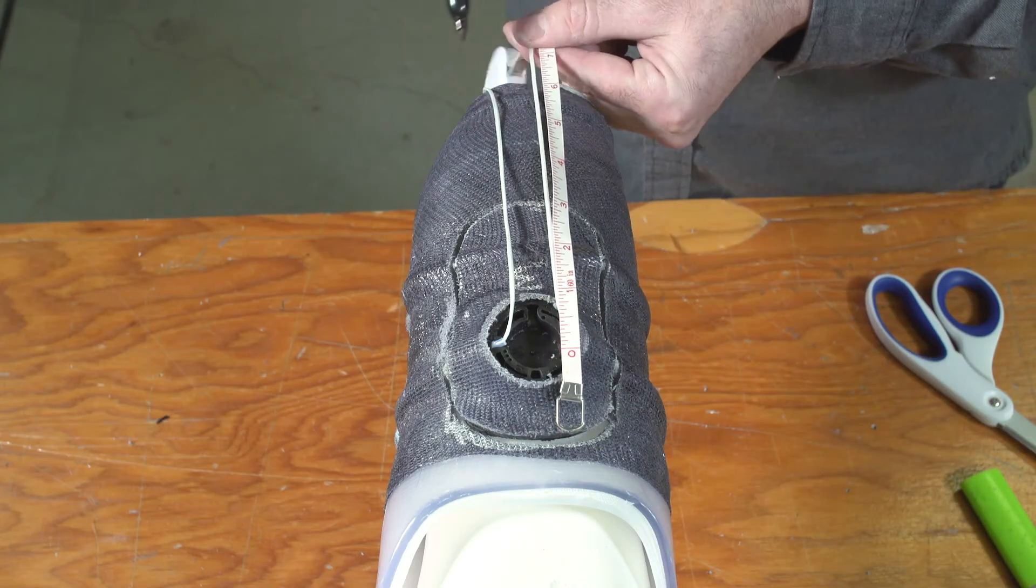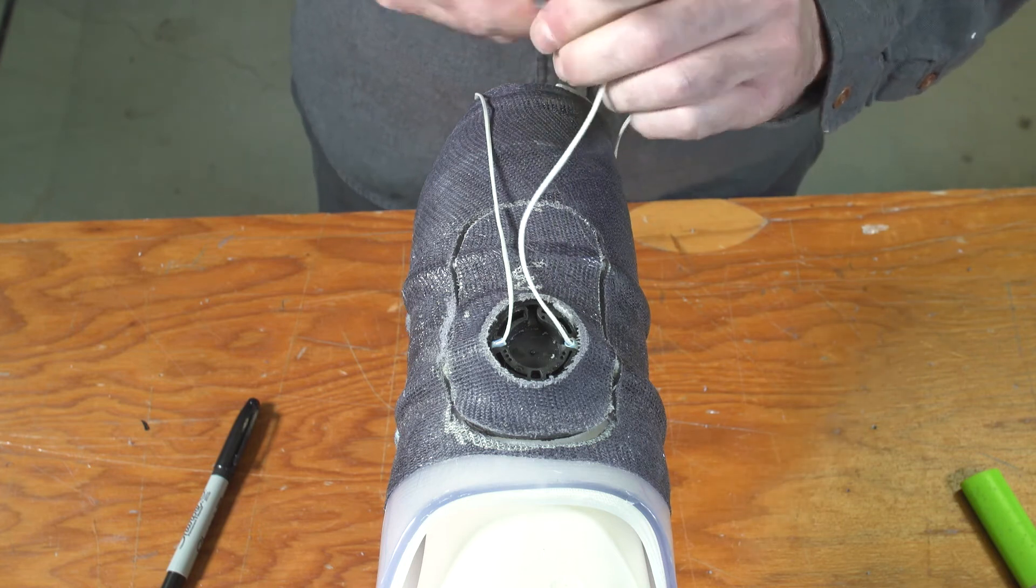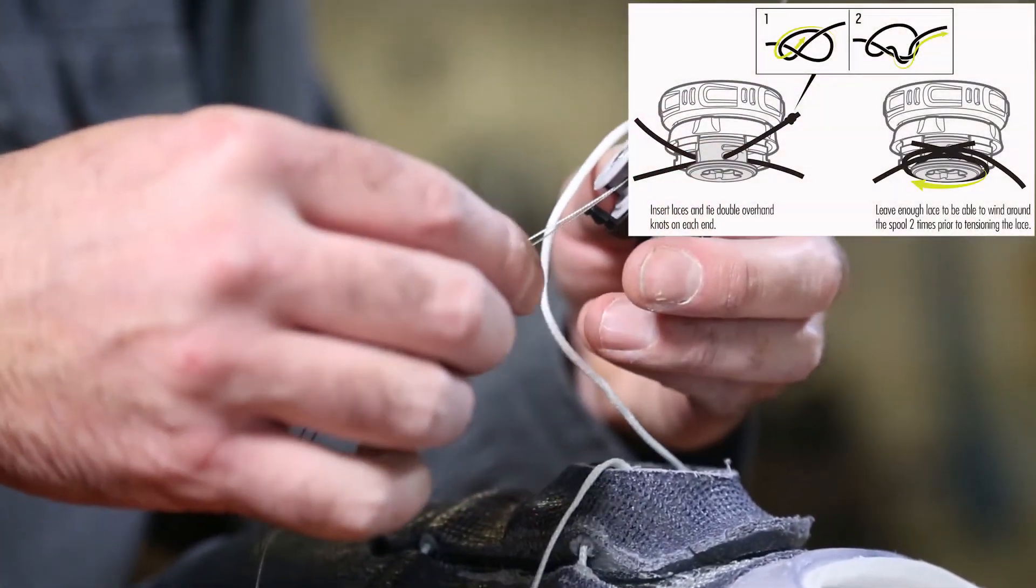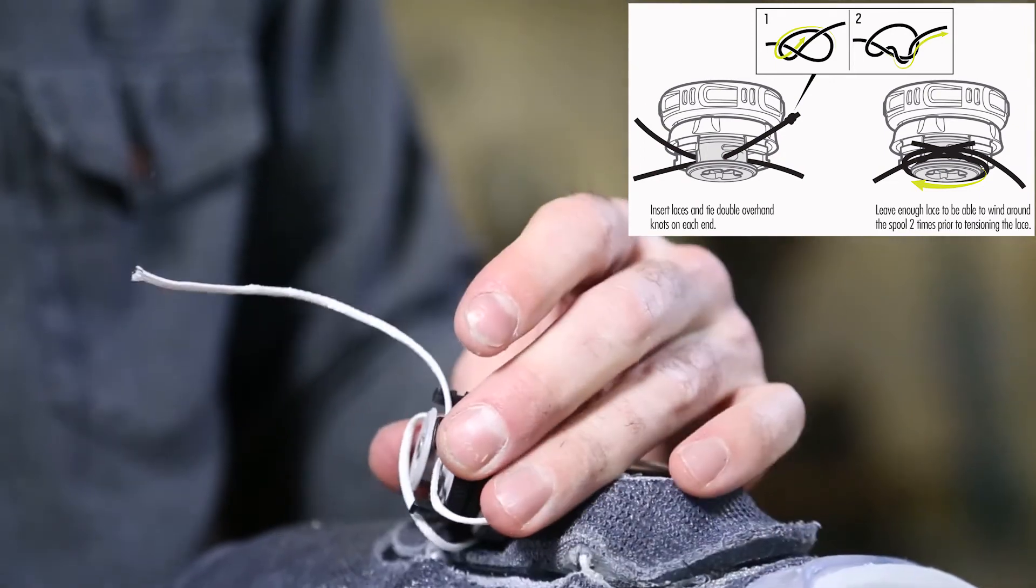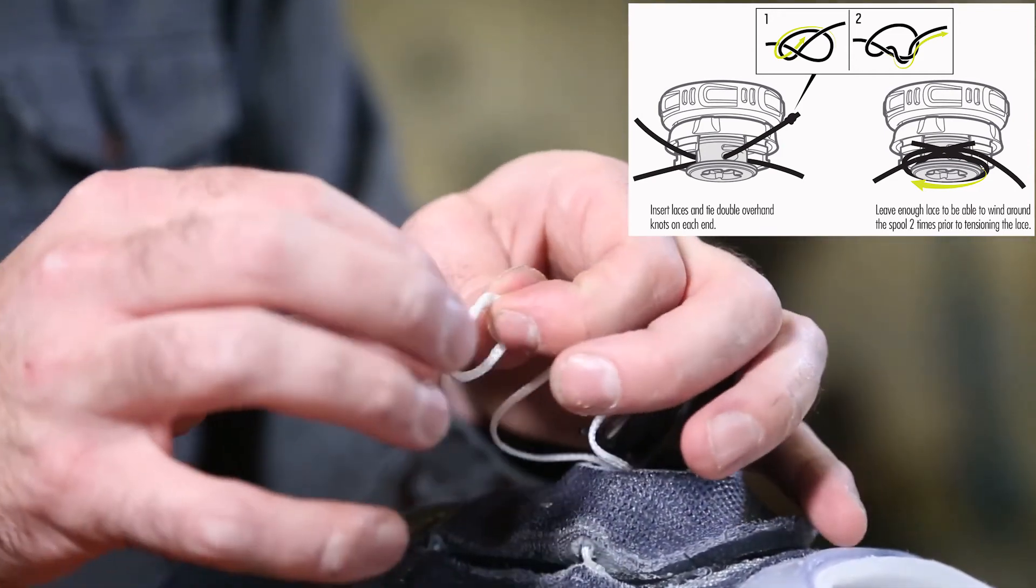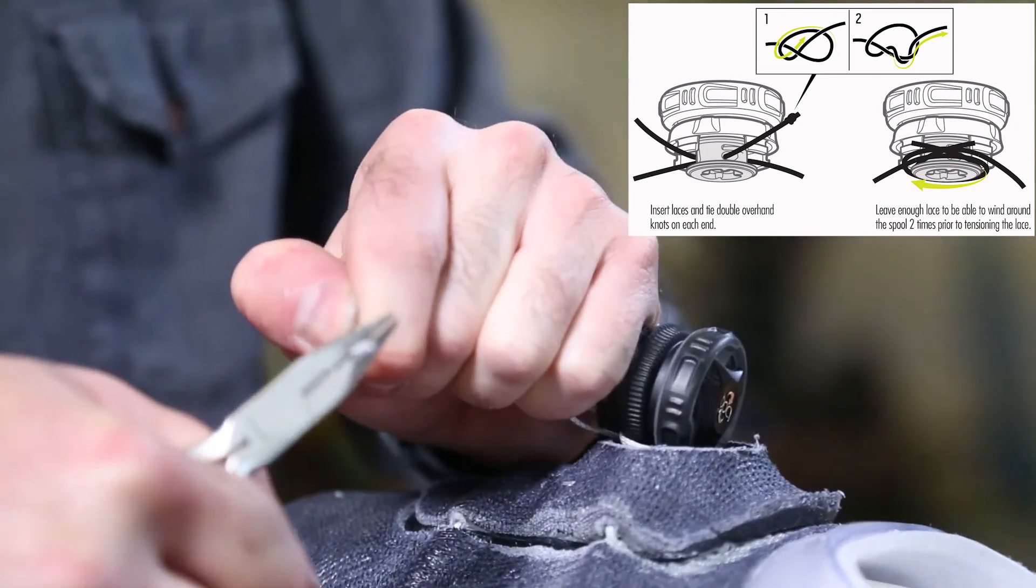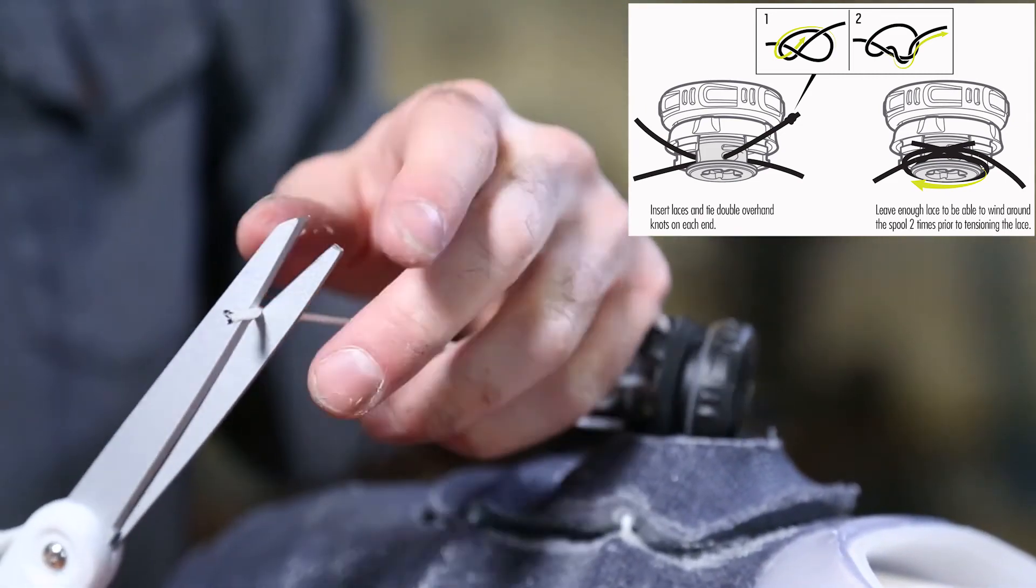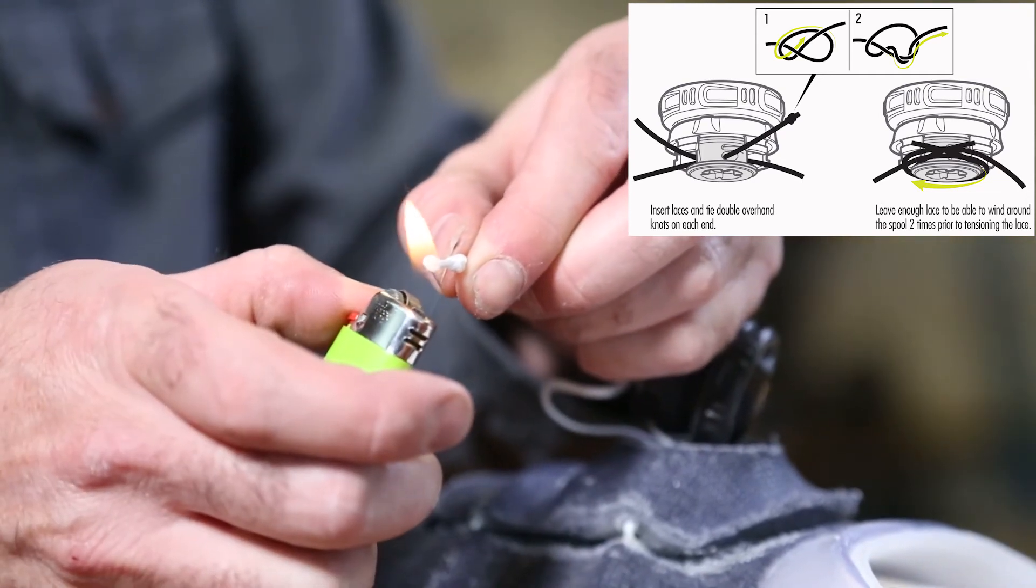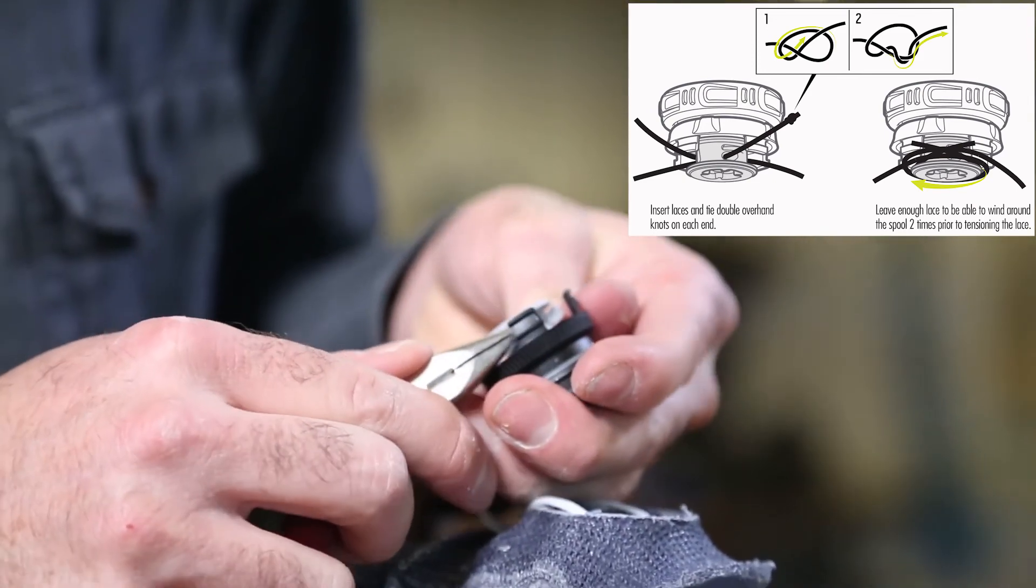Next, attach the lace to the dial. Cut the lace to length with the lace ends extending about 15cm beyond the dial base on both sides. Then use the wire lacing tool to thread the lace into one of the small holes on the dial and out of the corresponding large hole on the other side. Tie a double overhand knot. Trim, burn the end, and pull the knot into the dial. Repeat for the other lace end.